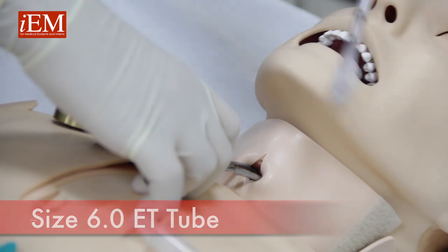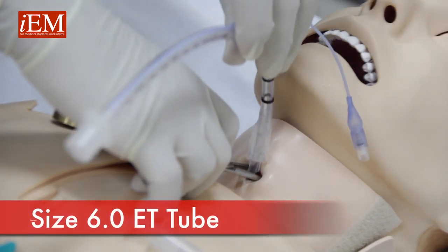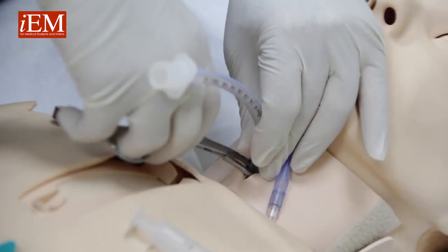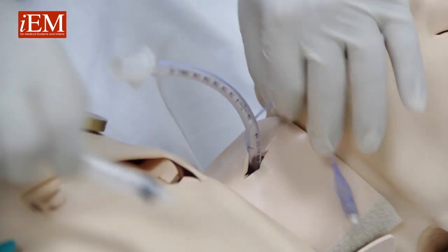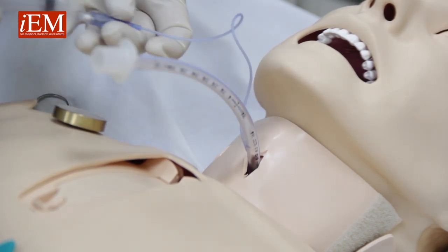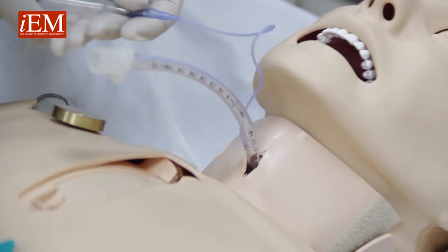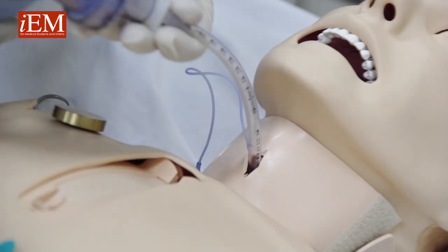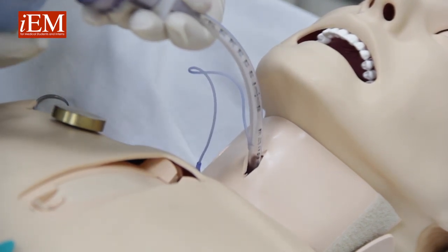Take the size 6 endotracheal tube between the Kelly, take your Kelly out, inflate the balloon, and you can now bag the patient.